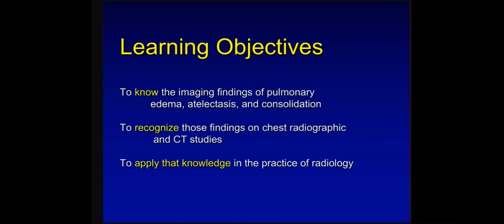The learning objectives of this talk will be to know the imaging findings of pulmonary edema, atelectasis, and consolidation, to be able to recognize those findings on both chest radiography and CT, and then to apply that knowledge in the practice of radiology.